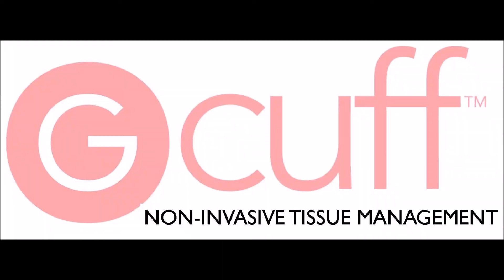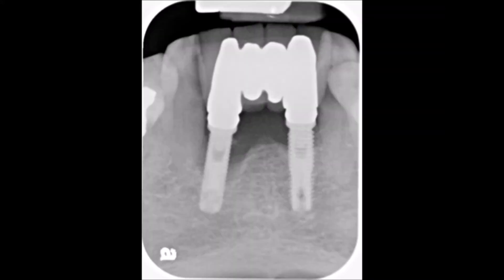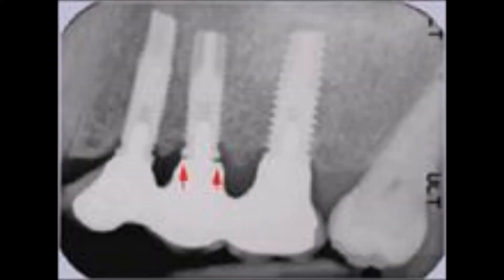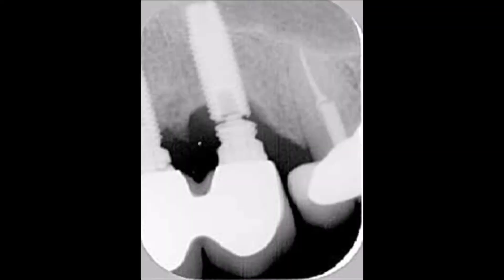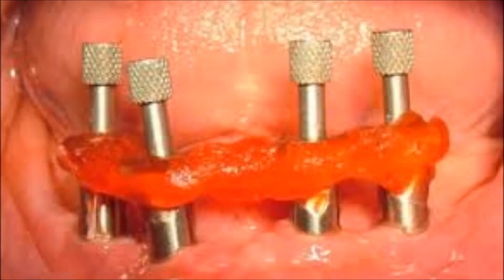G-Cuff is a dental implant gingival retraction device for impression and other applications. G-Cuff has been invented to solve problems of inaccuracies of implant transfer impressions. These inaccuracies compromise the fit of the restoration, causing irreversible damages to the tissues and bone, and can even cause implant breakage.